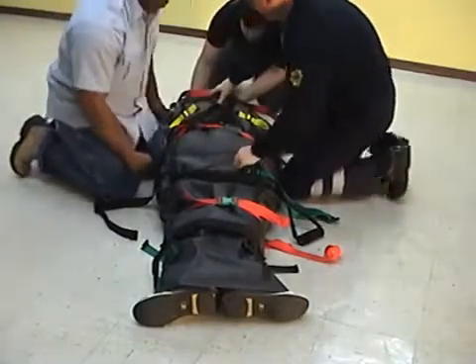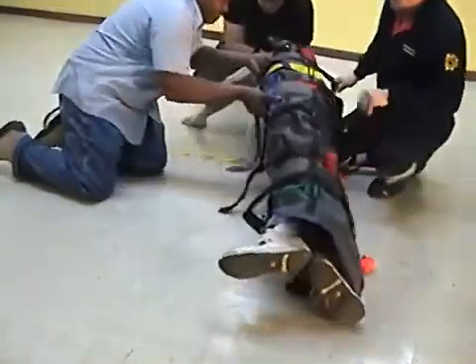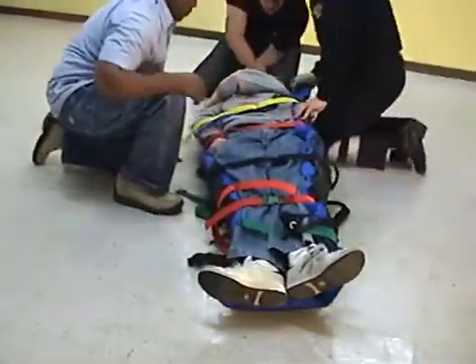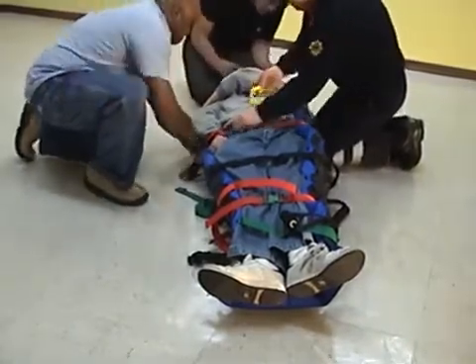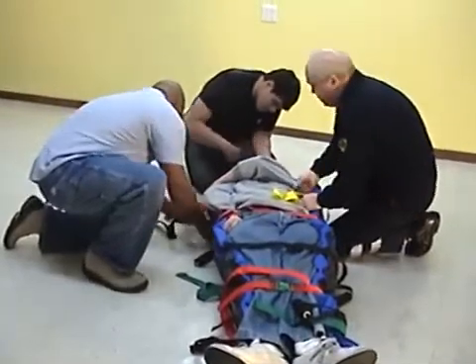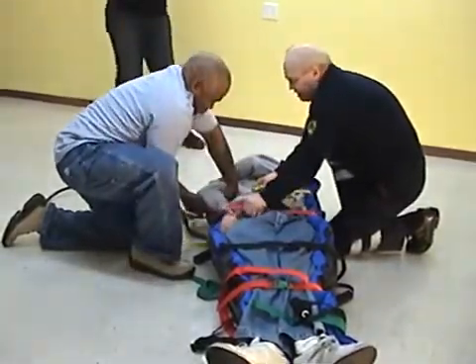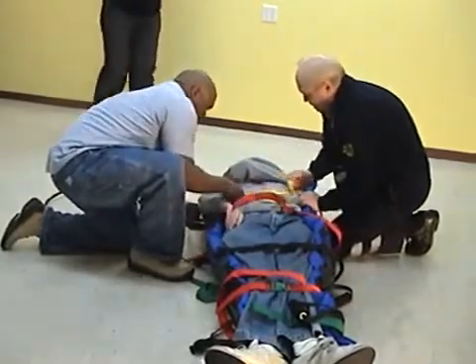At the command of head, all in unison, carefully roll the patient over to the face-up position. The more hands are available to hold the body in position, the better. Buckle up the straps in the same manner as noted in the previous instructions. Once the patient is face-up, the straps can be repositioned and adjusted to a better fit.